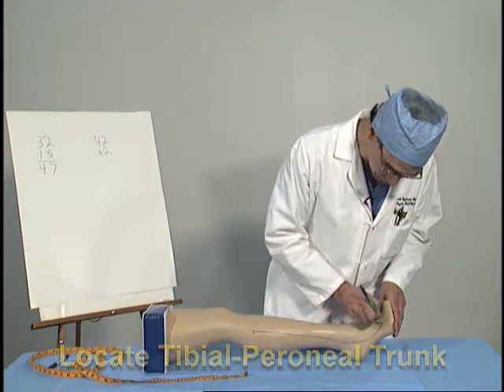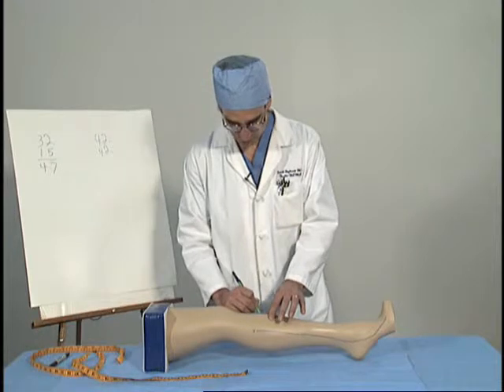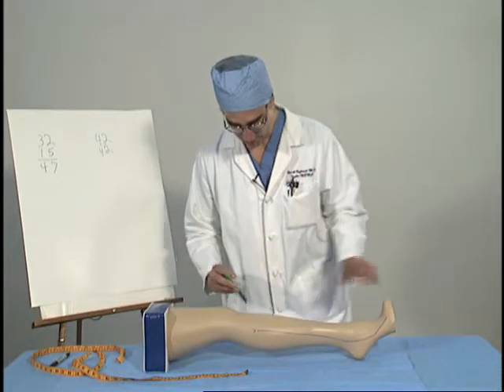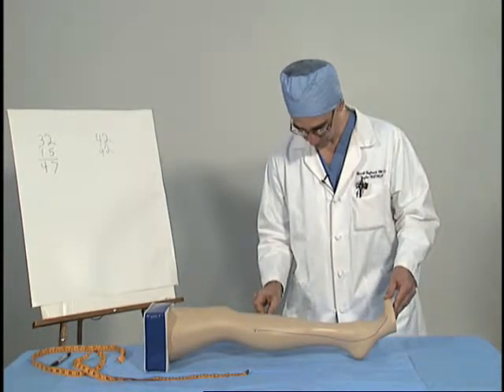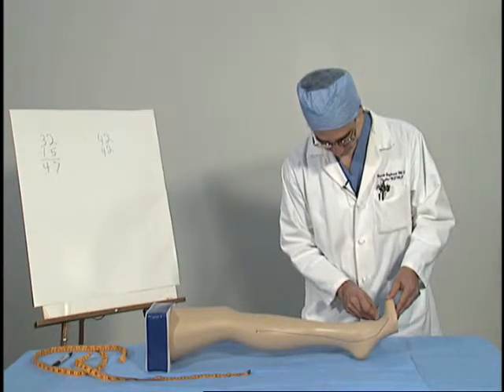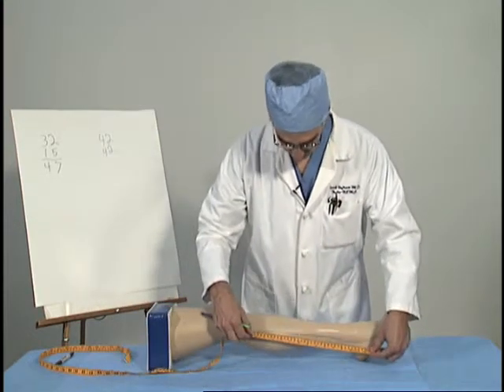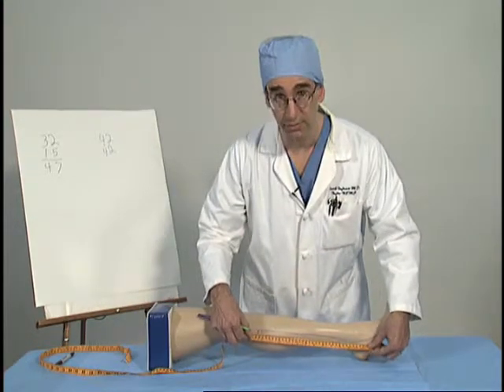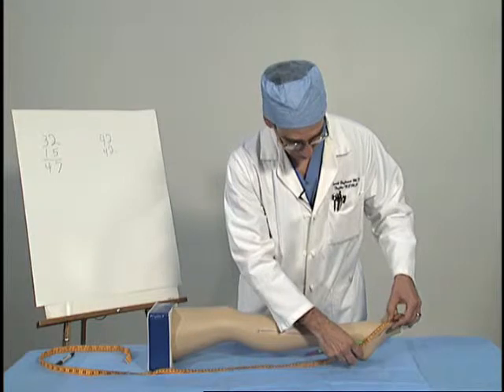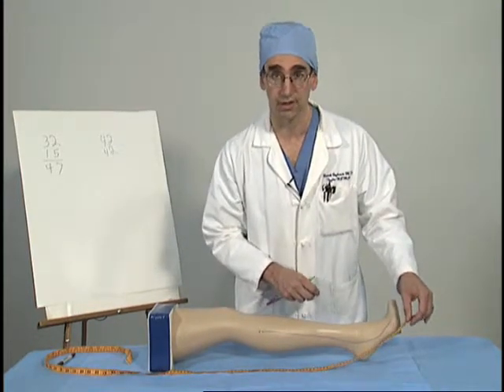measure our distance, do the same over the anterior compartment, just as in the last case, mark the site, extend onto the foot. We'll measure these out, and since this is the same mock-up leg that we used last time, we'll use our same 85 centimeter treatment length.